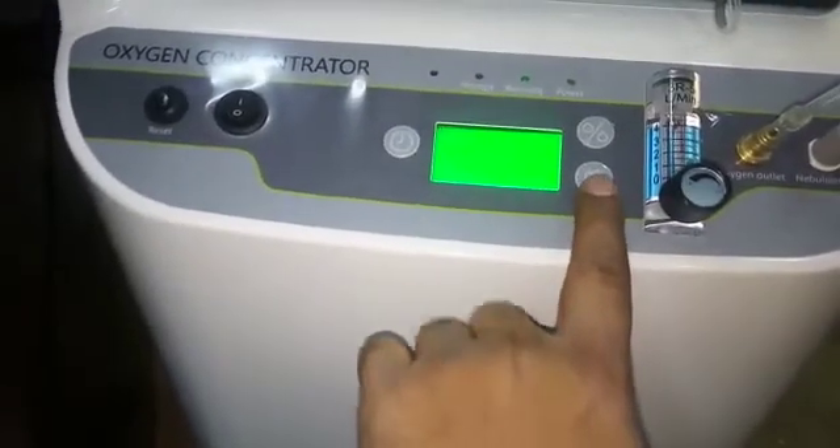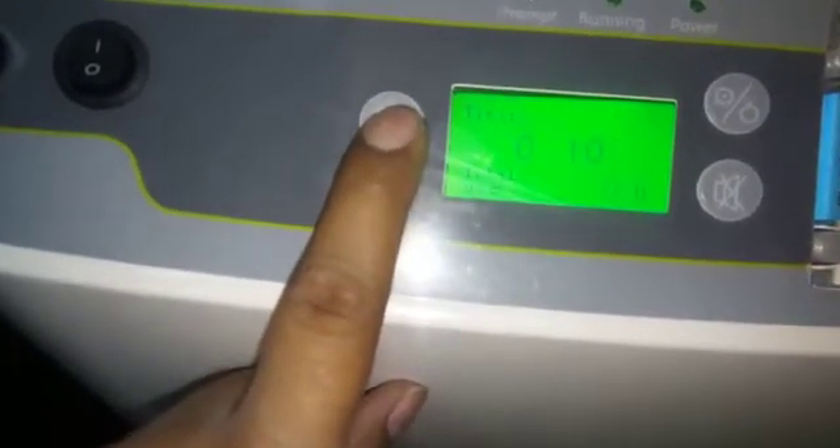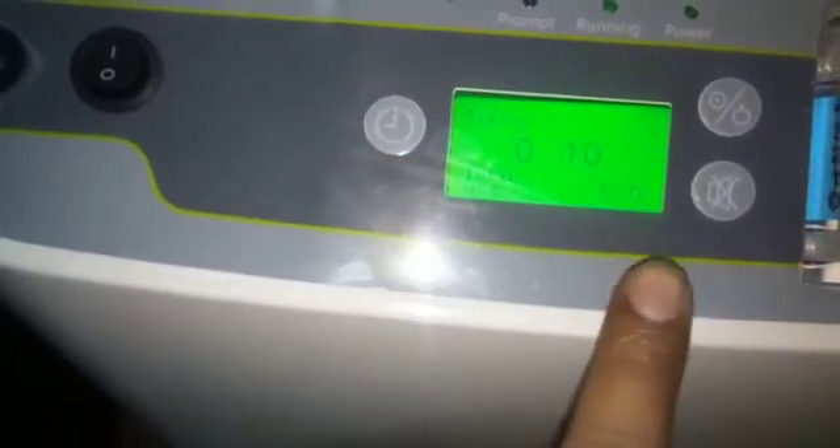This is the alarm mute button. This is the timer button. After 10 minutes, the machine will automatically shut down.